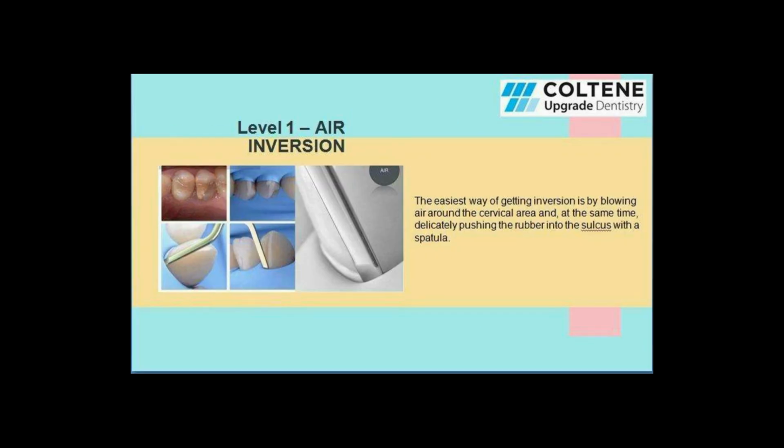Now there are four levels of inversion which have been discussed over here. Level one is the air inversion. In air inversion, we use the three-way syringe, and with very short blows of air, we try to tuck the rubber dam sheet inside the gingival crevice. As soon as we are blowing air with the help of the three-way syringe, with the help of a blunt end instrument, we try to tuck the rubber dam sheet inside the gingival crevice.